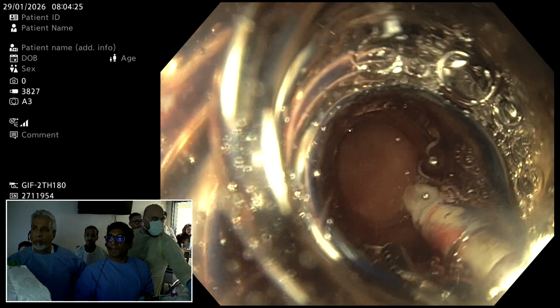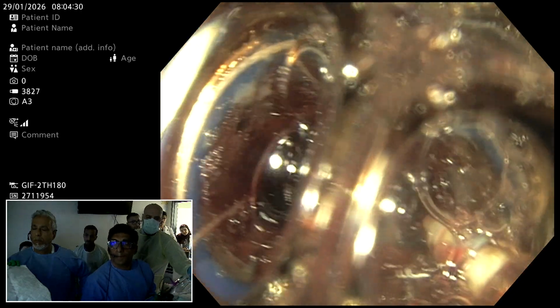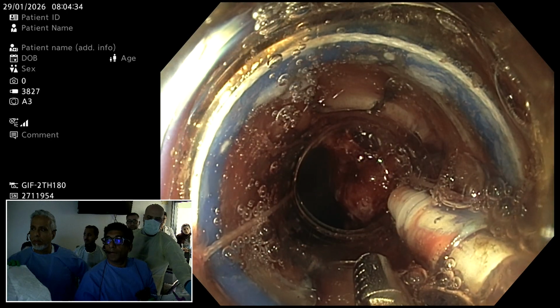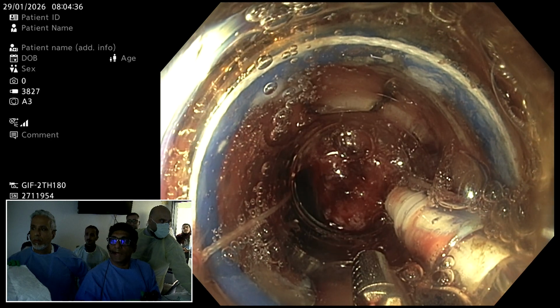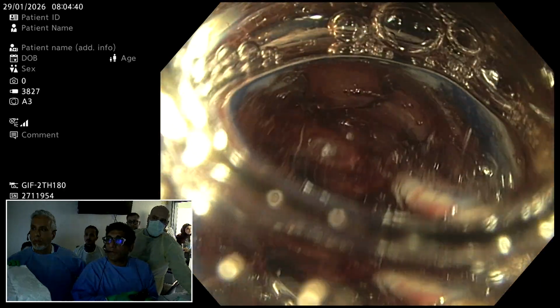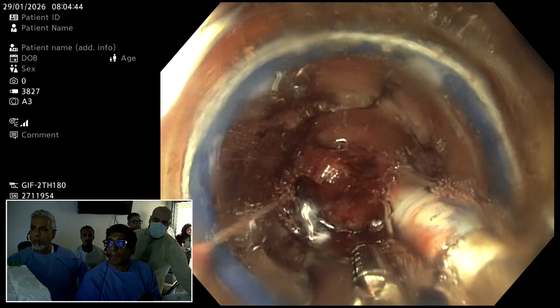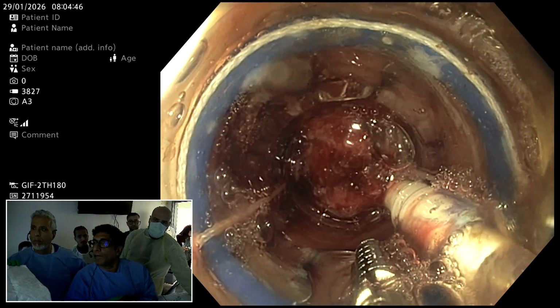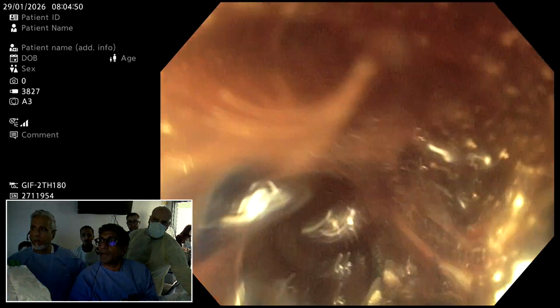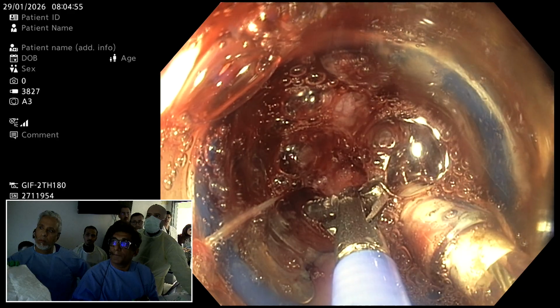Yes, yes, Pradeep. Yeah, yeah. Unfortunately that is not available here. So I'm seeing this tumor is now in. Open, open, please.